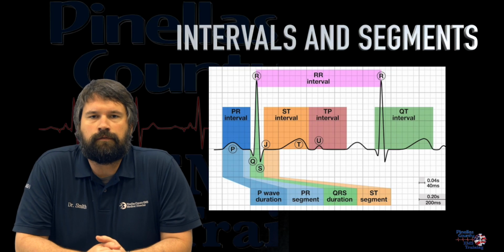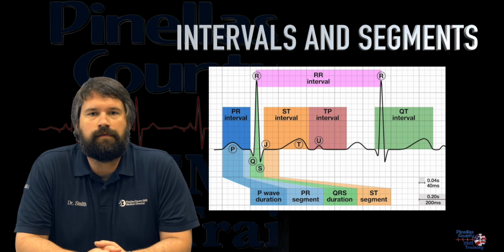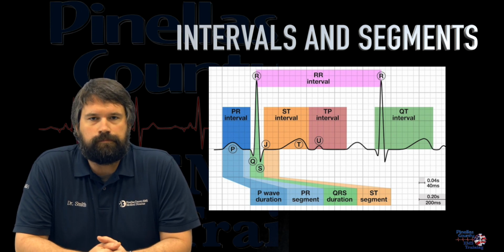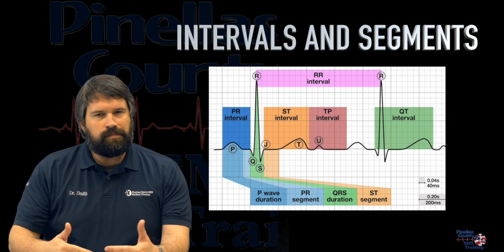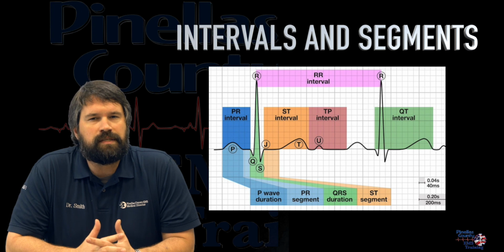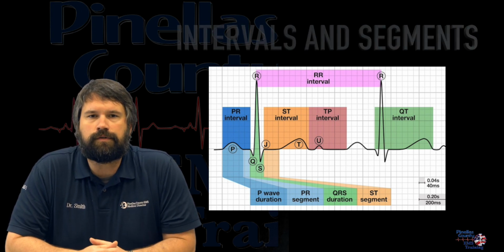So let's transition to intervals and segments. Notice that there is a difference between an interval and a segment. A segment connects 2 waves without including the waveform. However, an interval is the segment plus the wave. This is really important when we talk about specific disease states. However, for us, in general, you just usually want to talk about the intervals.